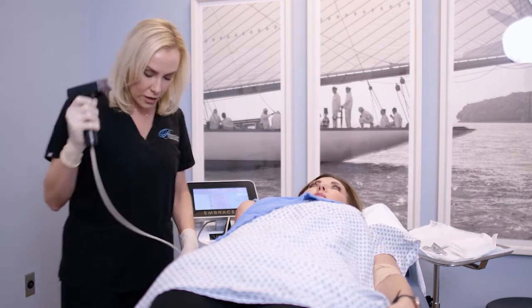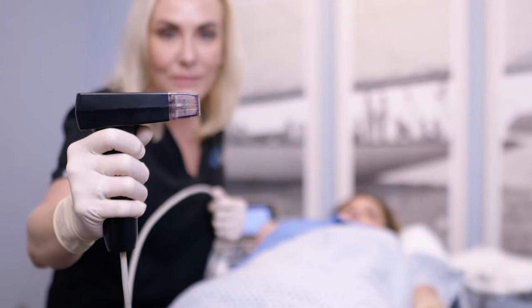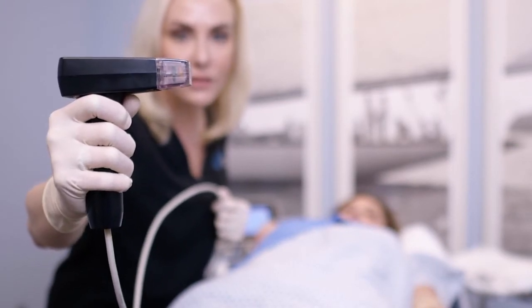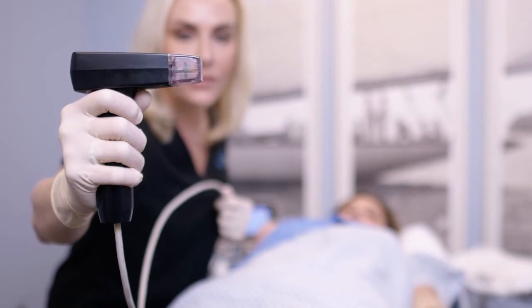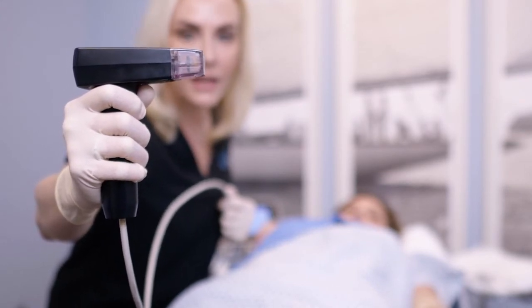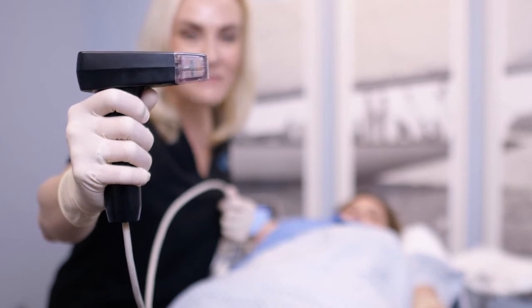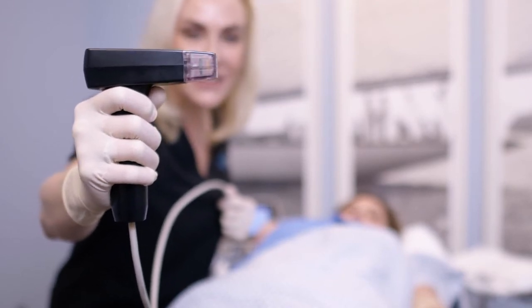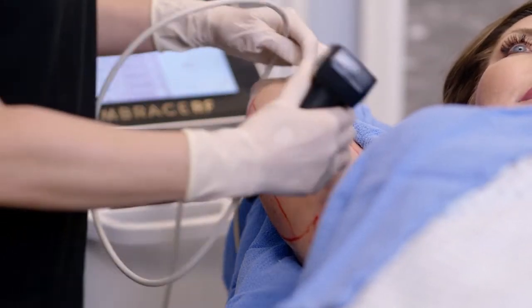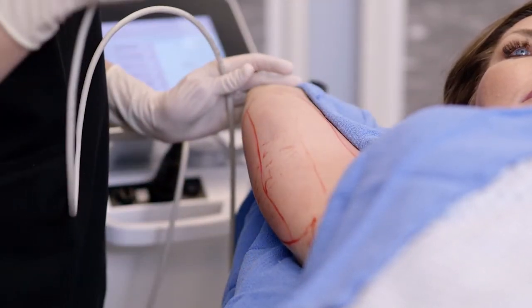All right, now, so I'm going to let you zoom into the handpiece here so that as I trigger the laser, you can actually see the little microneedles come out, and those will go into the skin when we apply it to the skin. It's going to make a strange sound when we do that because the laser is not in contact with the skin right now. All right, so we're going to get started. I'm going to start right over here.